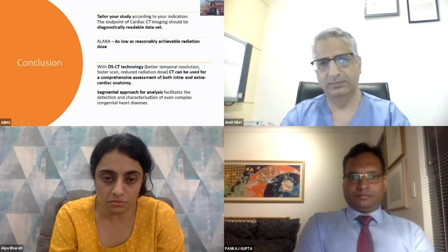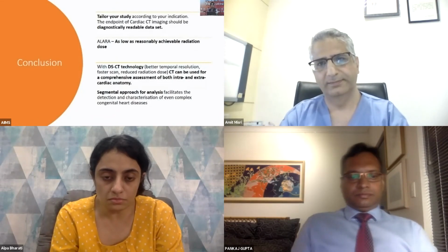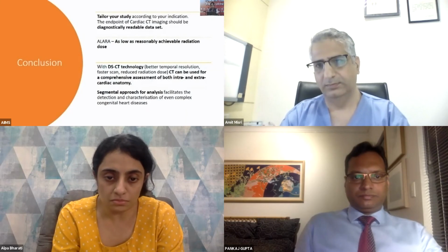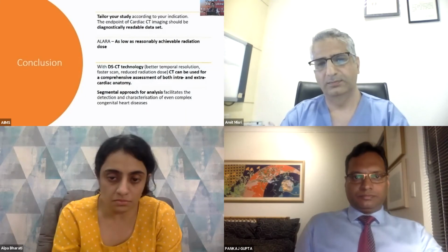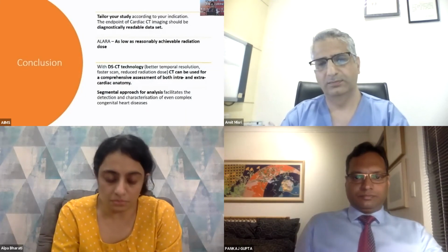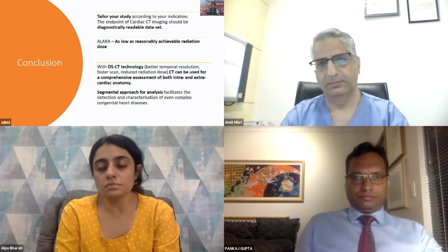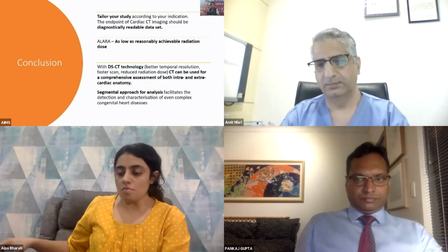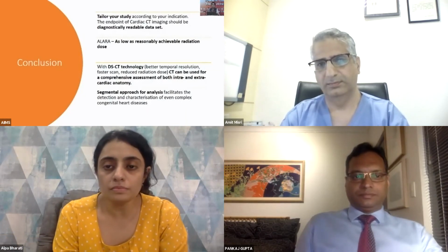So I would like to conclude: tailor your study according to your indication. At the end, you want a diagnostically readable data set. Use as low as reasonably achievable radiation dose. And with the advent of dual source CT, it is now possible to do intra and extra cardiac anatomy with less than 1 millisievert radiation dosage. And for the analysis, use a segmental approach to get the best possible results.